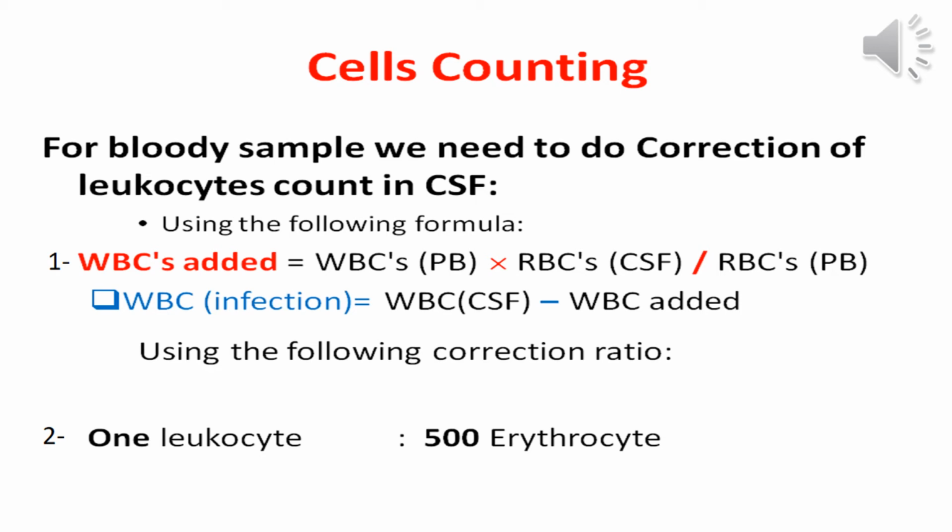In this case, remember that when you have a bloody sample, the blood comes from the peripheral blood and enters your CSF sample.